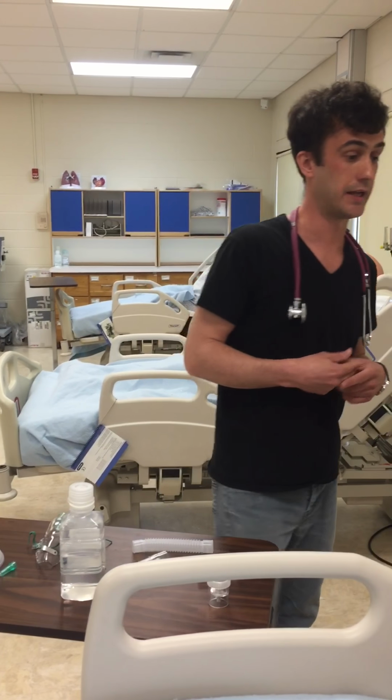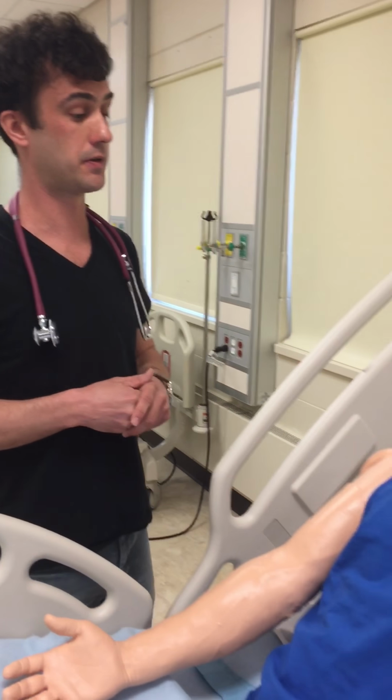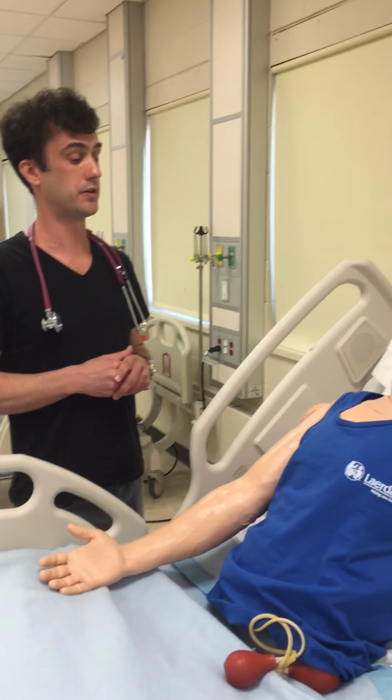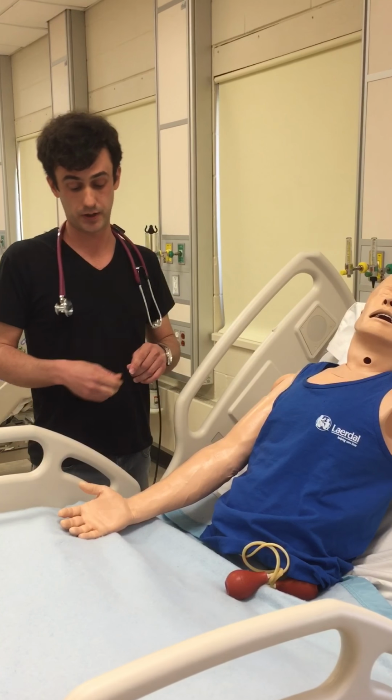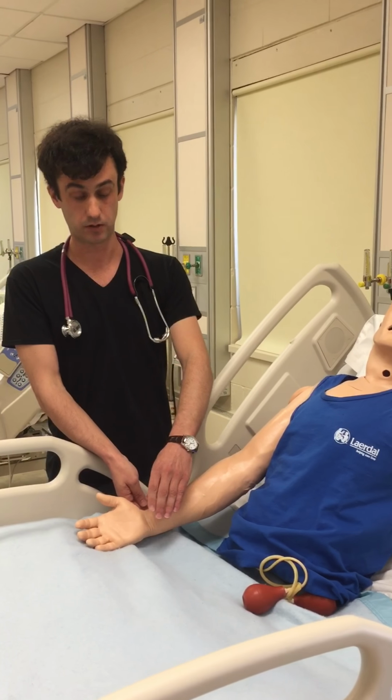I would then wash my hands for a minimum of 15 seconds and introduce myself to the patient. Hello, my name is Wayne. I'm from the respiratory department. Can you please tell me your first and last name and your date of birth? I would verify that information by checking the patient's wristband.